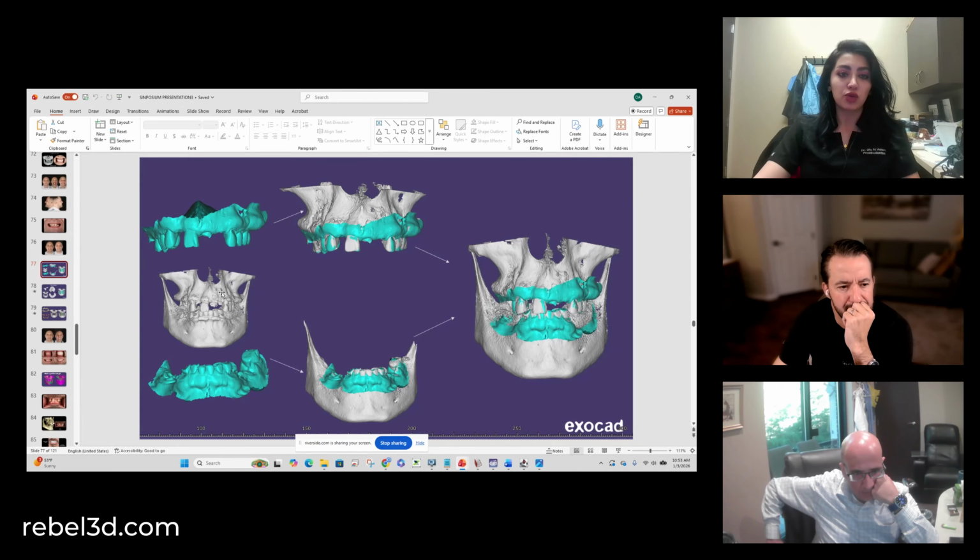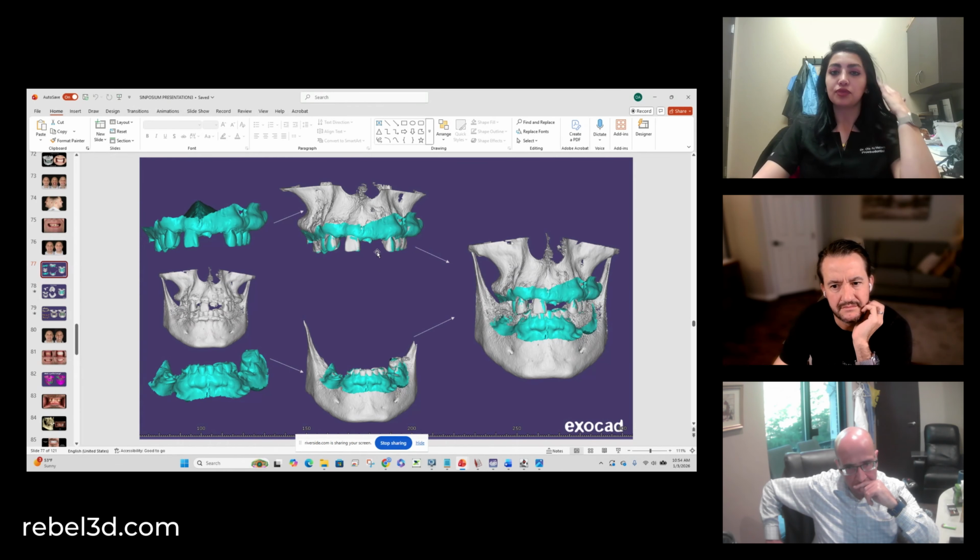Use your preferred method, whatever you're comfortable with. Here, for example, I'm using a leaf gauge, stabilizing the posterior teeth with some blue mousse, and taking the CT scan at that desired vertical dimension. Okay, so that's the first CT scan. Next, you're taking another CT scan with the teeth separated. You can separate with any kind of material, just make sure that it's not going to show in the CT scan. Something like cotton rolls will do, or a bite tab, something like that.